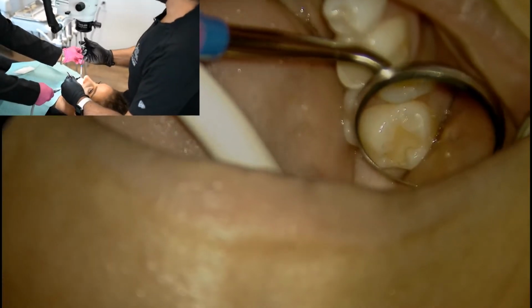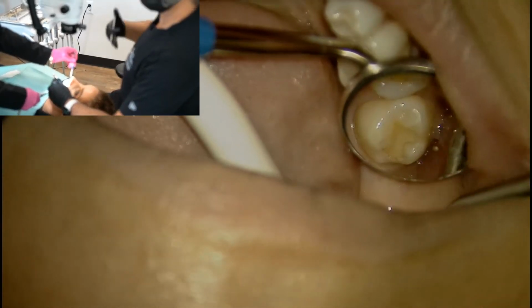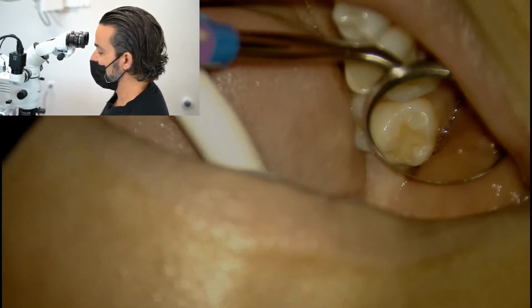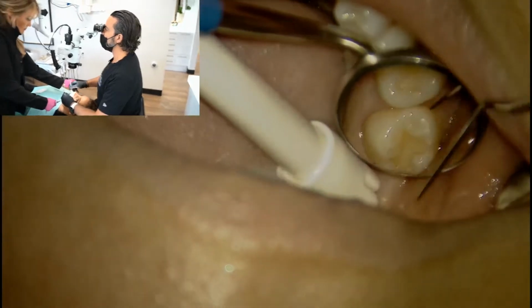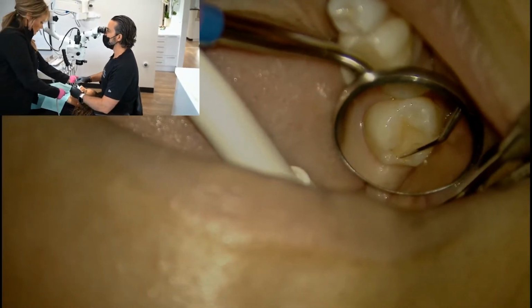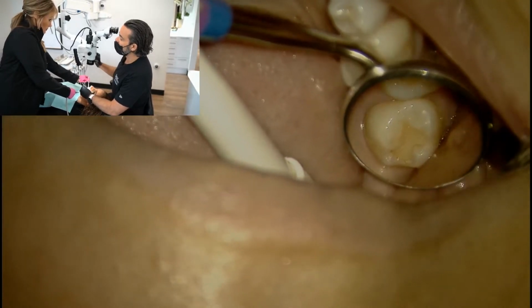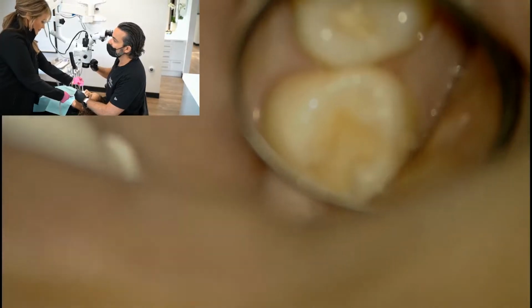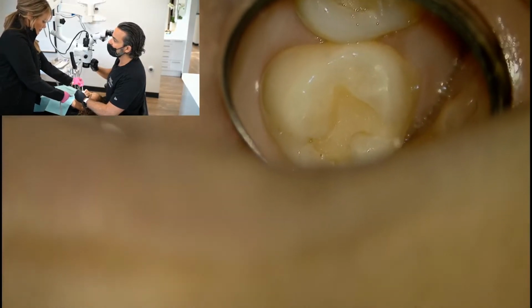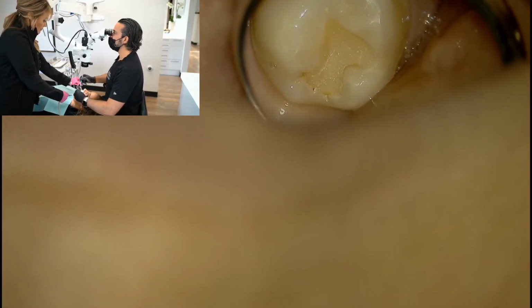Now, this is the posture. And now you can see where I'm at, where my neck is at, Michael, and my body position, my arms and my shoulders, and my Explorer. And it can proceed to kind of inspect the quality of this restoration. There we go. So we can magnify this up a bit, and take a look at some fun defects here.